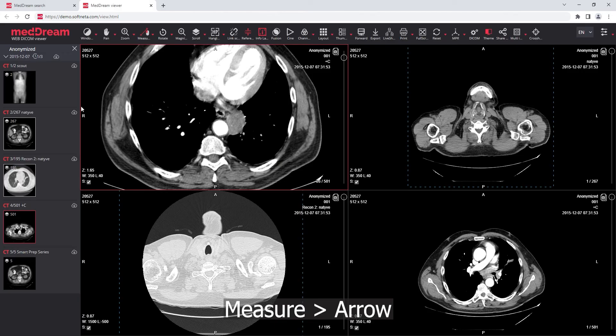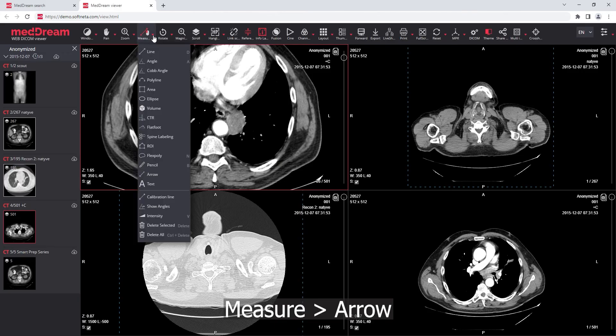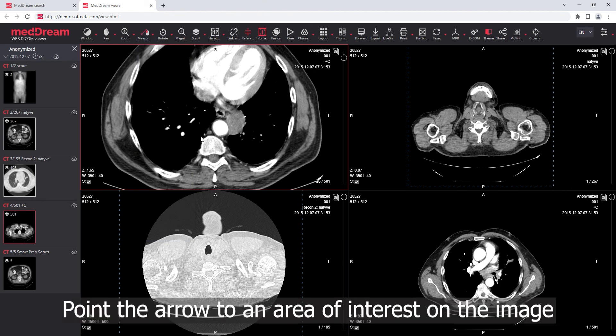Arrow Pointer: mark an area of interest on the image. Choose the arrow tool from the measure menu and point the arrow to an area of interest on the image.